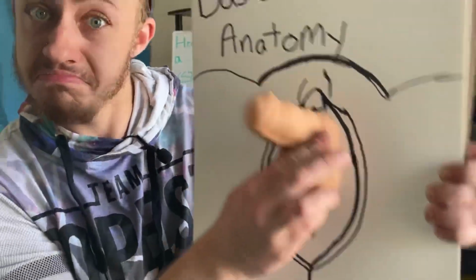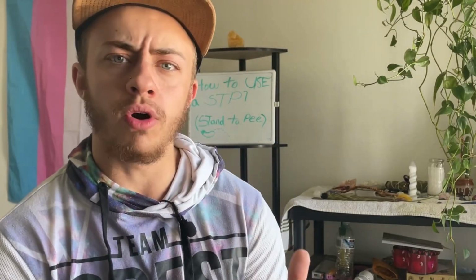So another reason why you might be peeing on yourself is your pee control and pee power. If you've watched any of my STP reviews in the past, you know that I have a very powerful stream. Because of that, I've had to train my bladder to only pee a little bit at a time if I'm using an STP. Every STP is made a little bit different.